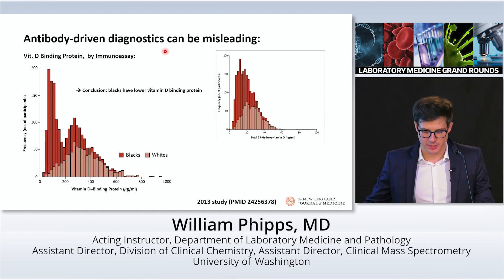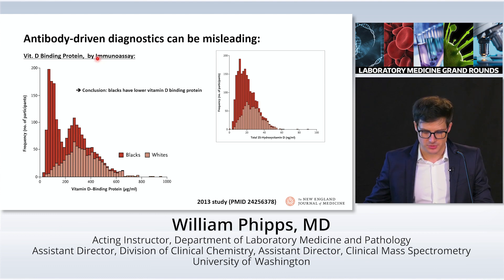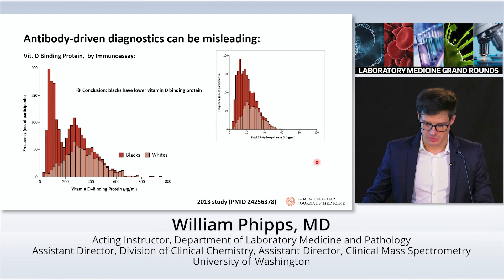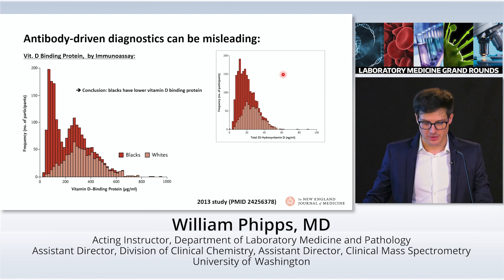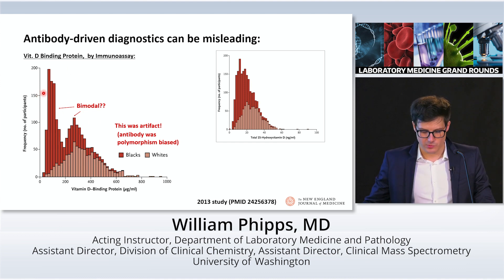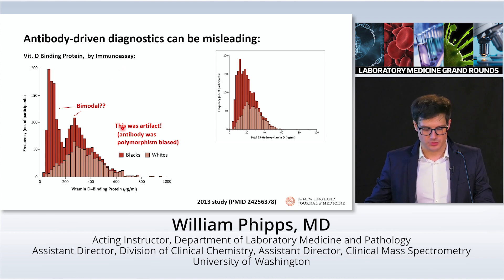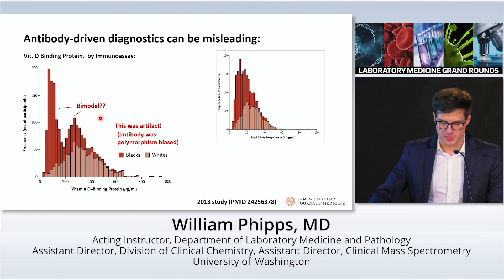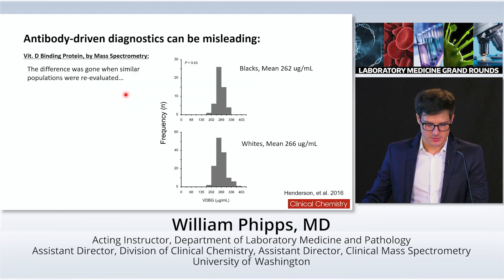Our exposure to this in the chemistry division primarily comes from our examination of circulating protein markers, and many of the same lessons apply in solid tissues. In one prominent example — an article from 2013 published in the New England Journal of Medicine — it argued that Black individuals overall have lower amounts of vitamin D binding protein compared to whites, offered as a potential explanation for apparent differences in vitamin D levels between races. As it turned out, this bimodal distribution was actually an artifact: the antibody used was polymorphism-biased, giving an unequal response to different underlying forms of vitamin D binding protein. When reanalyzed using mass spectrometry in a similar set of populations, these differences largely go away.